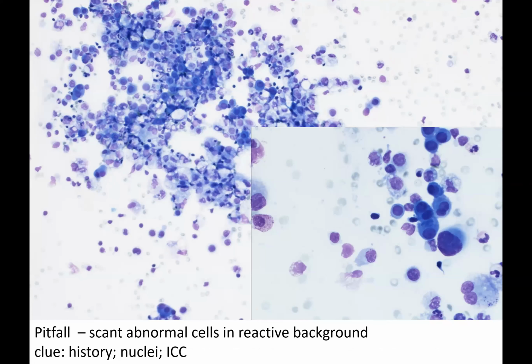Another pitfall in interpreting metastatic adenocarcinoma is when you've got very few abnormal cells. And here's another case, this time lots of inflammatory cells with macrophages and mesothelial cells in the background. But here and there are these cells with a very large nucleus, high nuclear to cytoplasmic ratio, and irregular nuclear outlines.